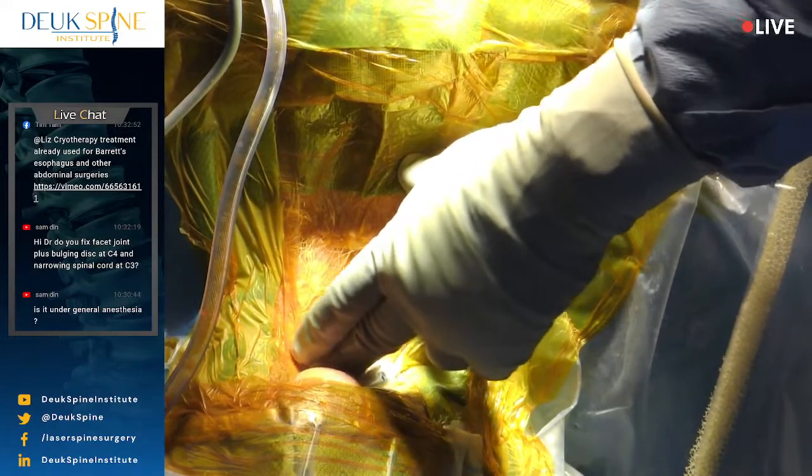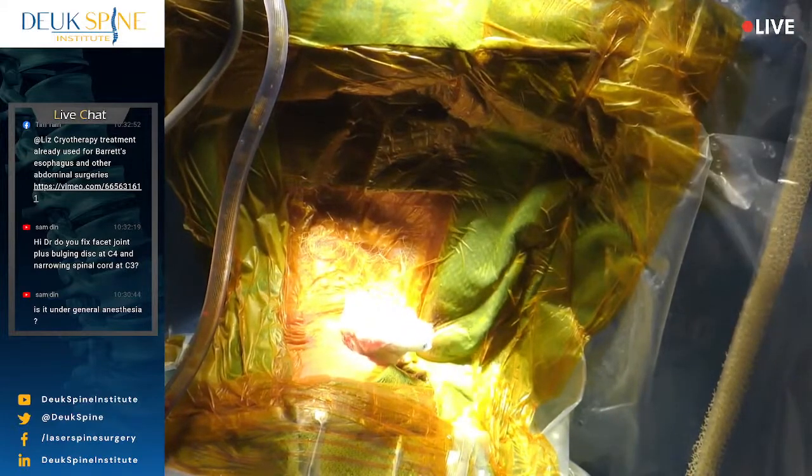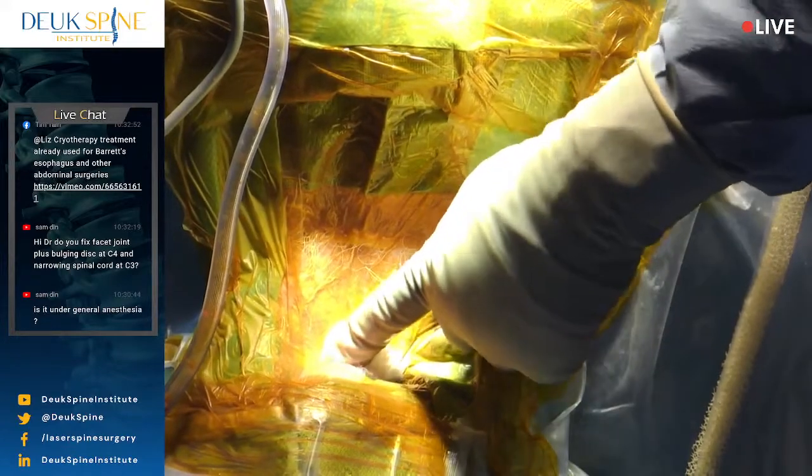Next, we're going to go down to C6-7. So let's get a shot and see what we got. That looks good. So 2, 3, 4, 5, 6, 7, the bird beak. Everyone agree? All right, so hopefully we don't need any pulling at all. Let me see what I can do with my fingers, my magical little fingers.